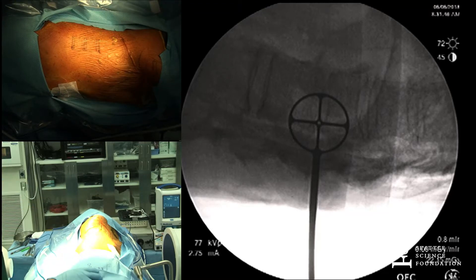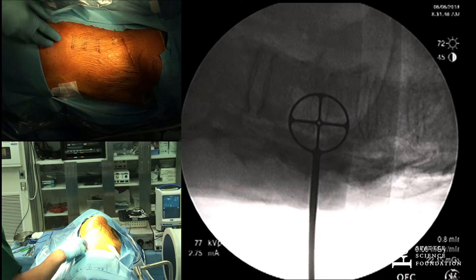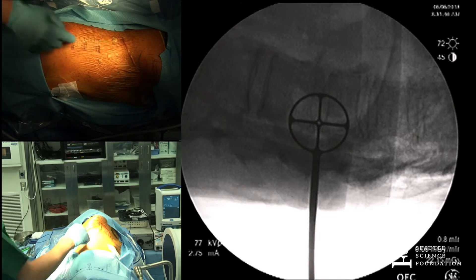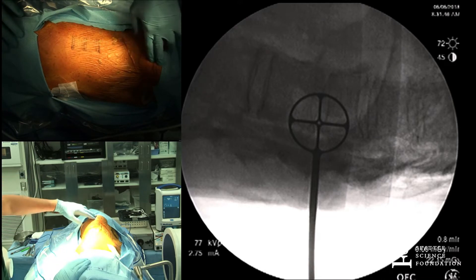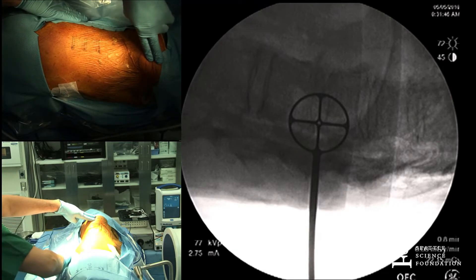We switched the body around a little bit, so this is the thoracic spine, and I marked out the disc spaces in the vertebral bodies. This is the iliac crest on the bottom, and then this is the top, this is anterior, and this is posterior.